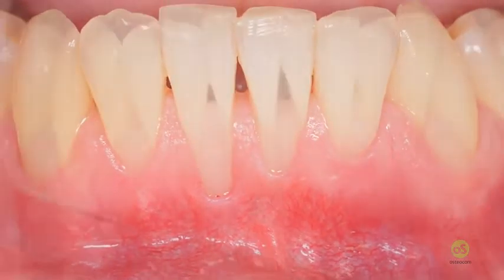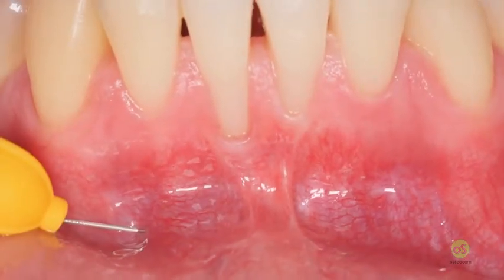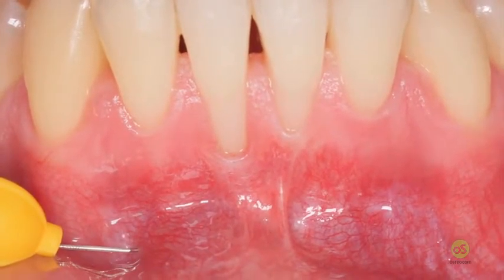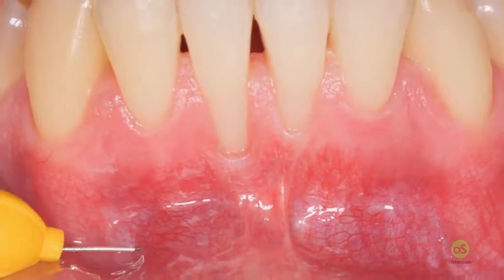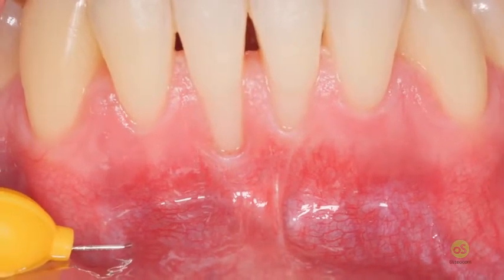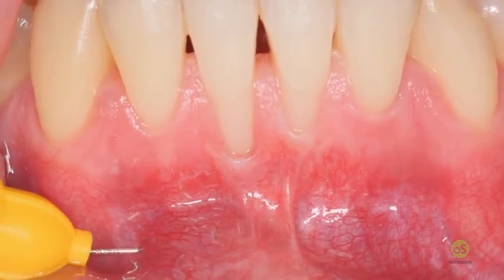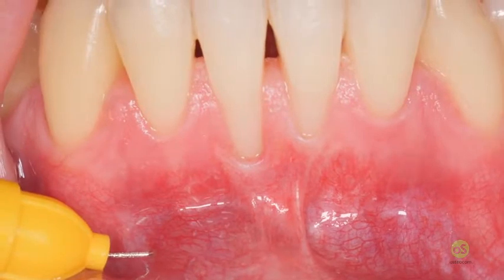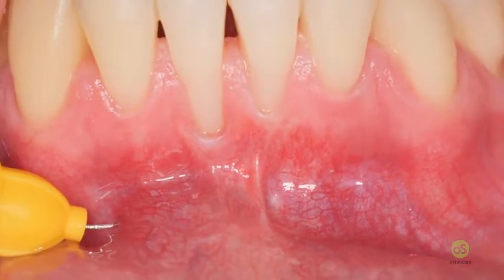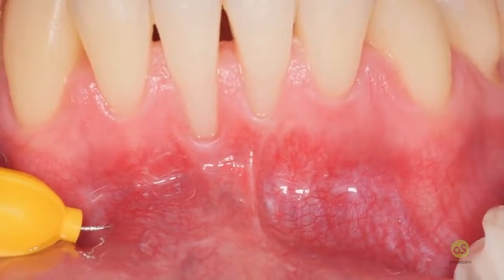The anesthesia has to be done far away with respect to the surgical area. The needle is bent towards the interincisors area. I start a very slow injection. In the lower incisors it is even more important that the injection is very slow, because we don't want to create any trauma to the alveolar mucosa of the lip. That is the alveolar mucosa that we will use for verticalizing our flap.